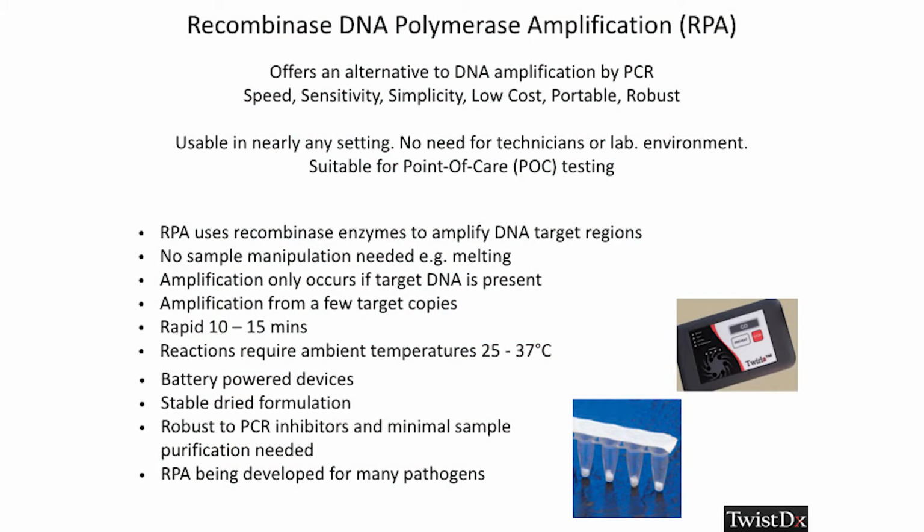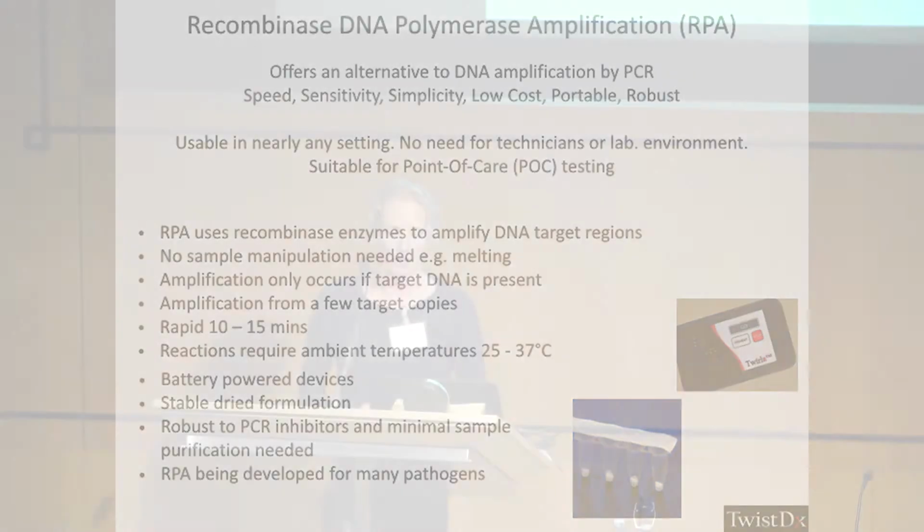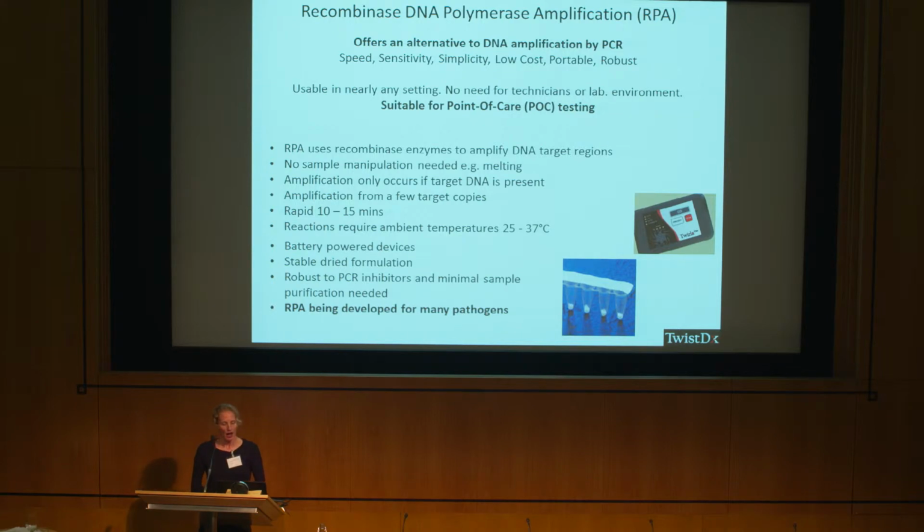And the way that the reaction works, it uses very low-powered battery devices. The actual chemistry and the enzymes are stored in a stable dried formulation, which can be taken out to endemic countries. And also, these enzymes are resilient to inhibitors.